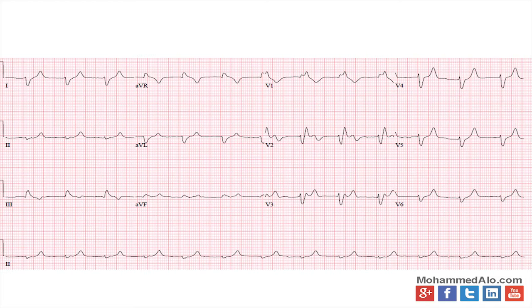Next EKG is what? You have very wide QRS complexes, very broad T waves. They're down and dull and diminished. You almost don't even see a P wave in these. This is hyperkalemia, not just mild. If it was mild, you'd have those sharp elevated T waves. This is more than mild. This is getting towards moderate or severe.